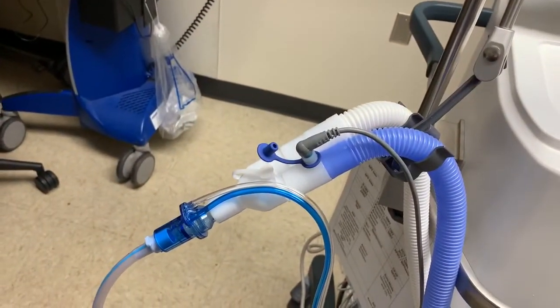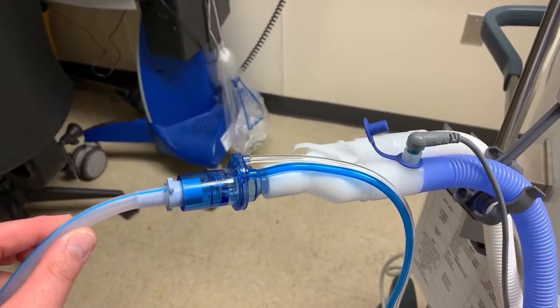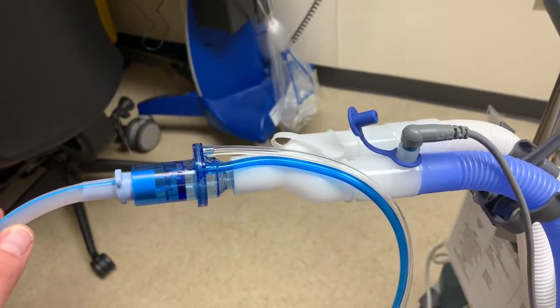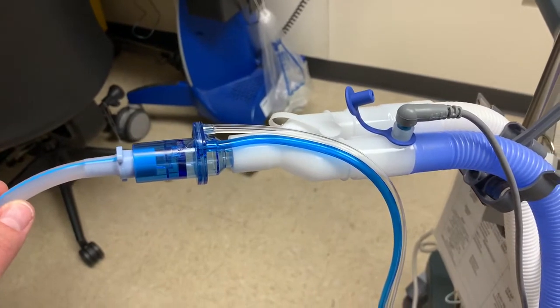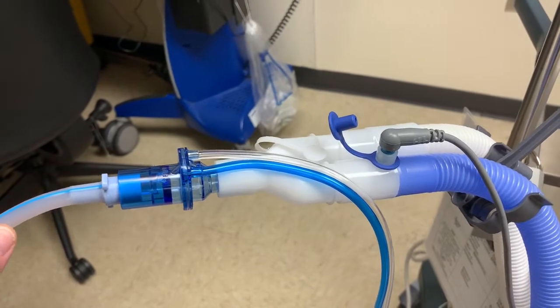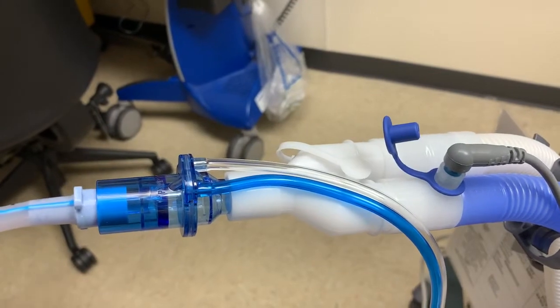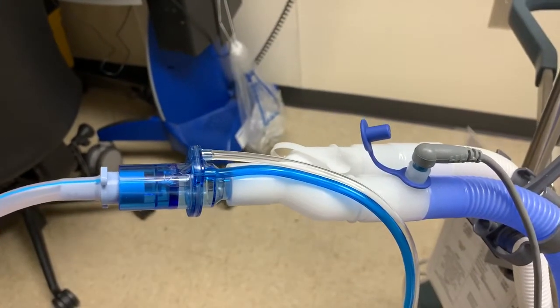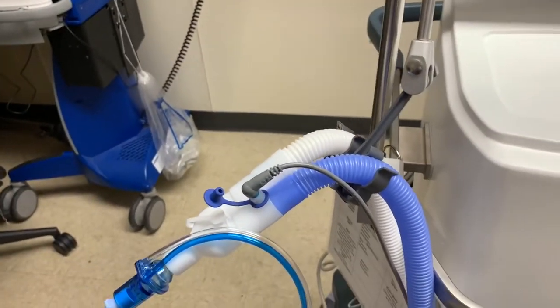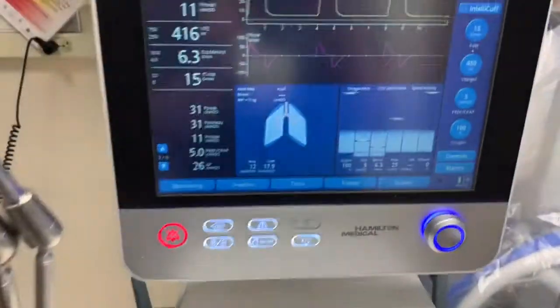The way that the vent measures the peak inspiratory pressure and tidal volume is a little different than any other ventilators. You'll see that it has a flow sensor in line from the circuit to the patient. This provides more accurate readings as it's measuring directly at the patient. To provide the best readings, you want to make sure that the clear and blue lines are pointing upwards towards the ceiling. If it is not and condensation occurs, it will travel back to the ventilator and give false alarms.